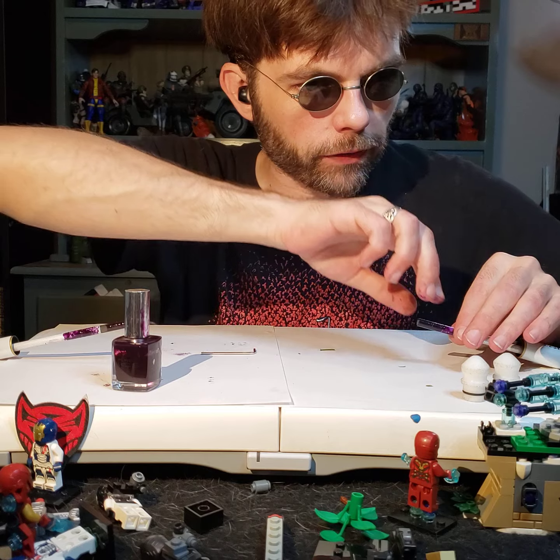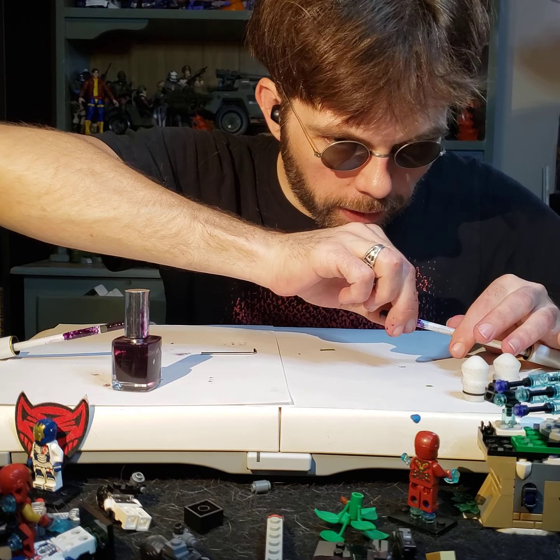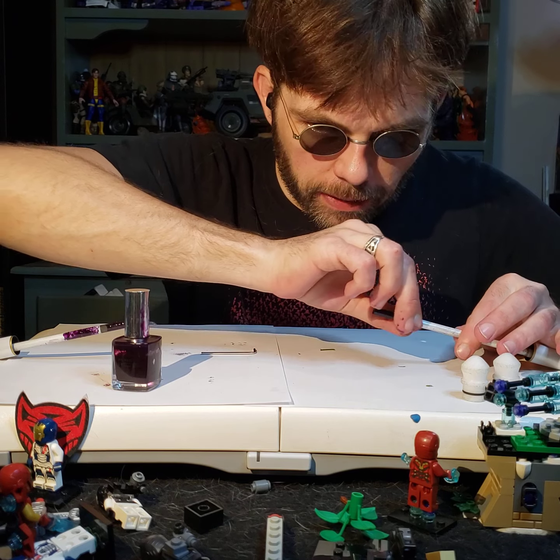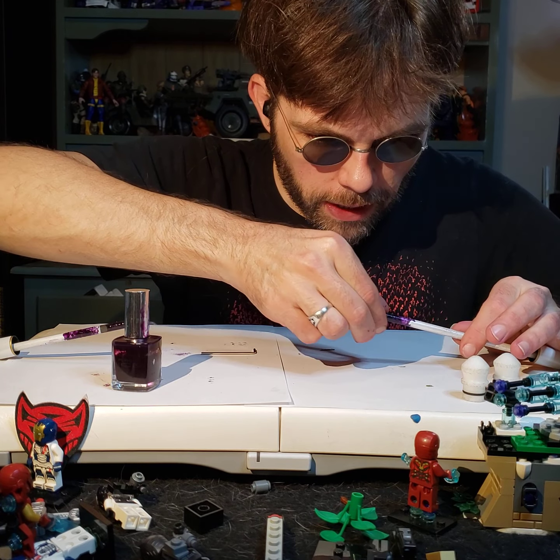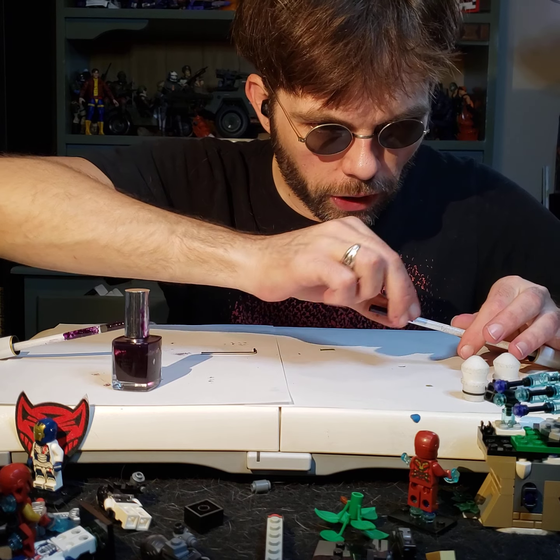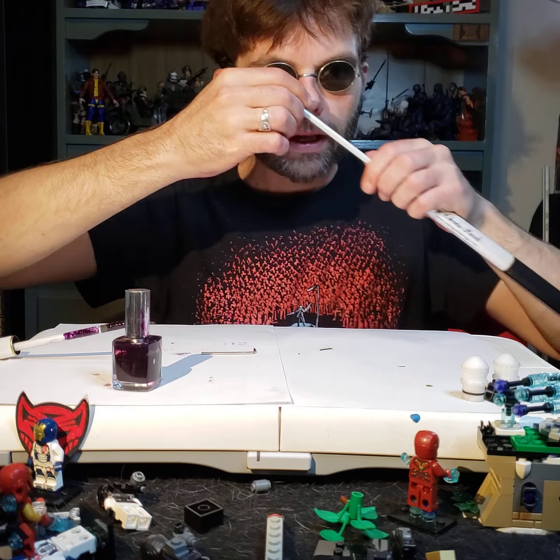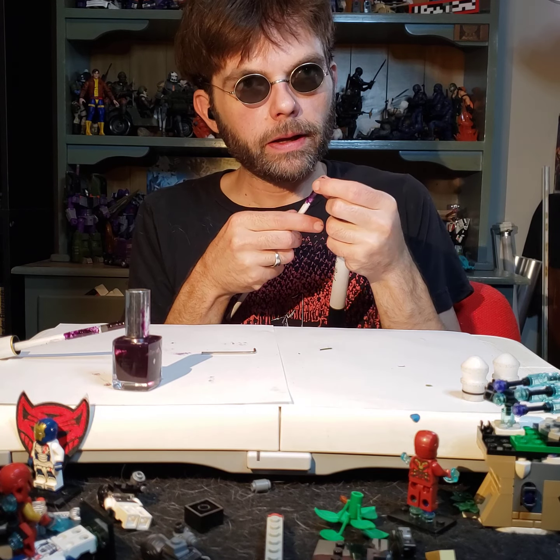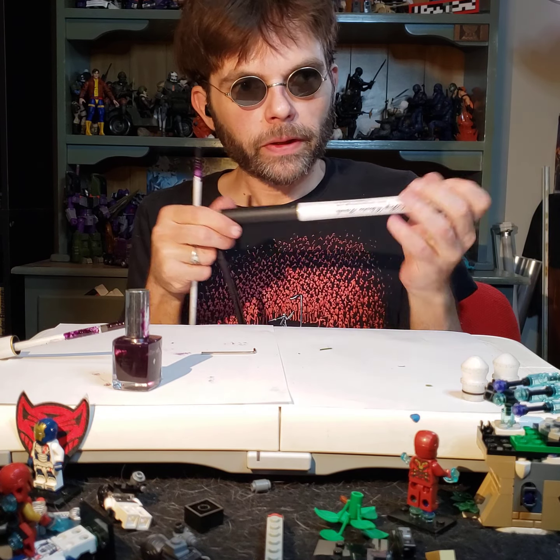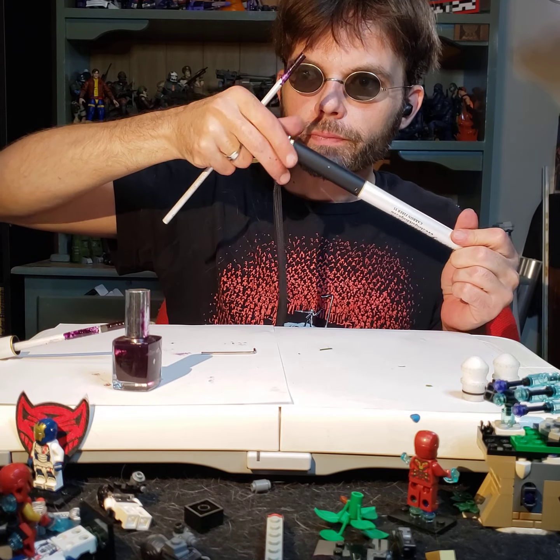Let's check our other guy over here that we just finished working on a minute ago. And there we go. That is rough. That is exactly the texture I wanted to achieve. A rough texture. It feels thicker than the rest of the cane below it. That's also important because we want this to stick. So now that I checked it for tackiness and proof that that is some fast drying nail polish, let's go ahead and unscrew the end of our cane here.